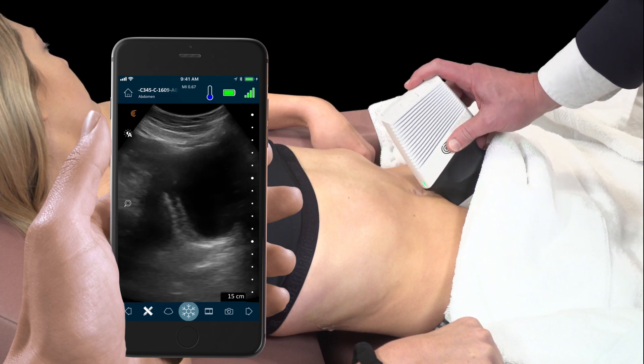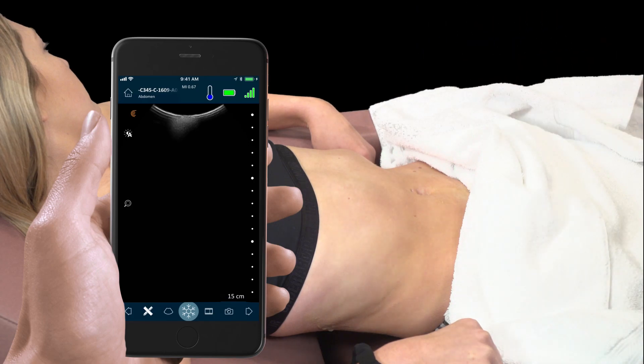This has been a brief introduction to renal ultrasonography for the nephrologist. We looked at assessing renal parenchyma, evidence of hydronephrosis, and looking at the bladder for evidence of distention.